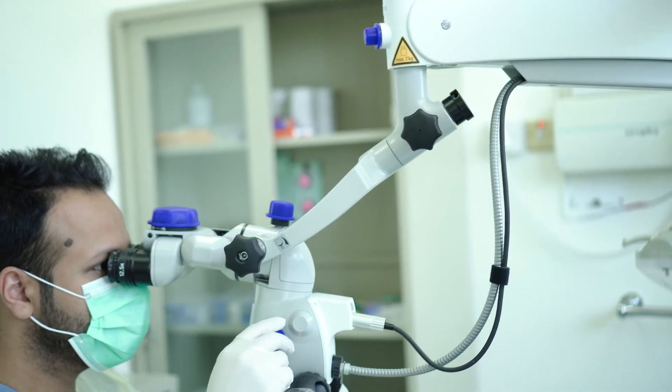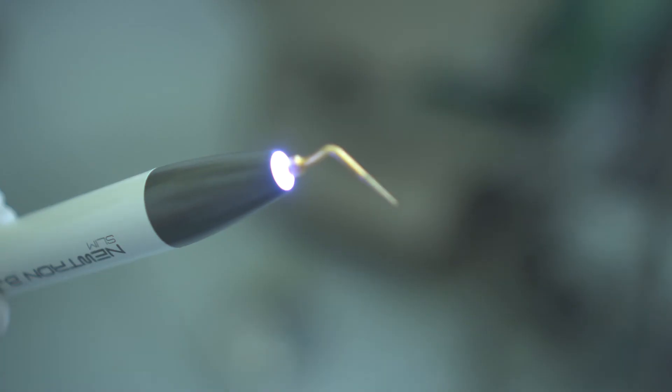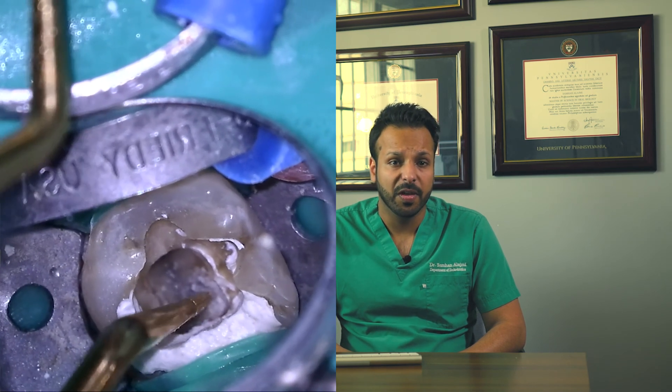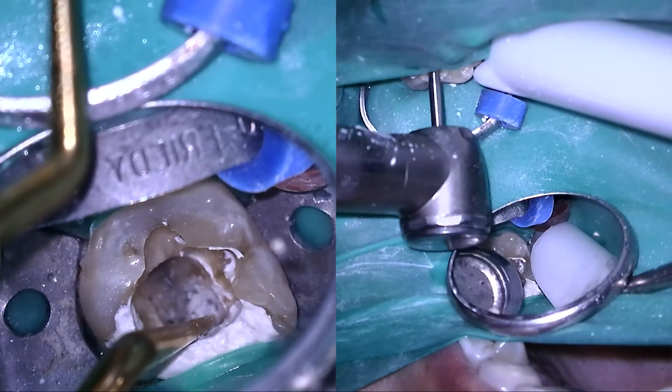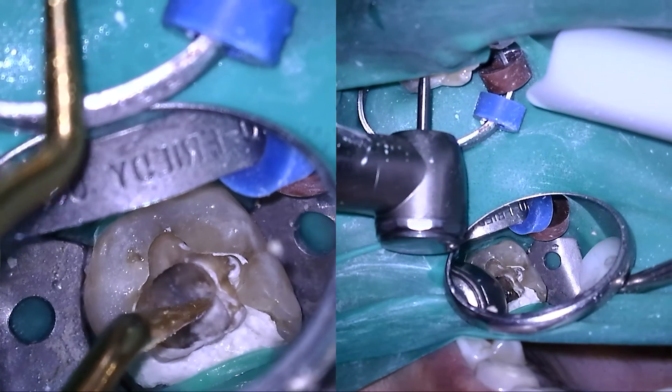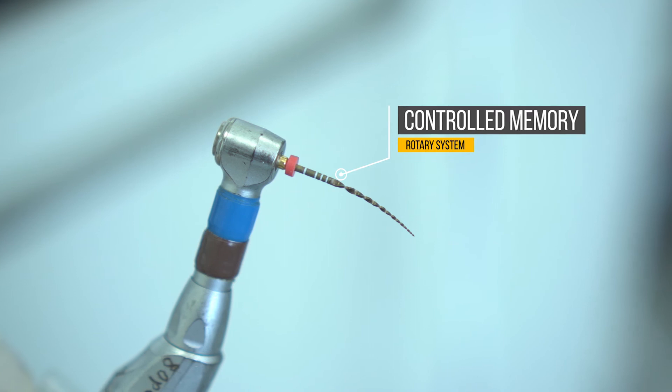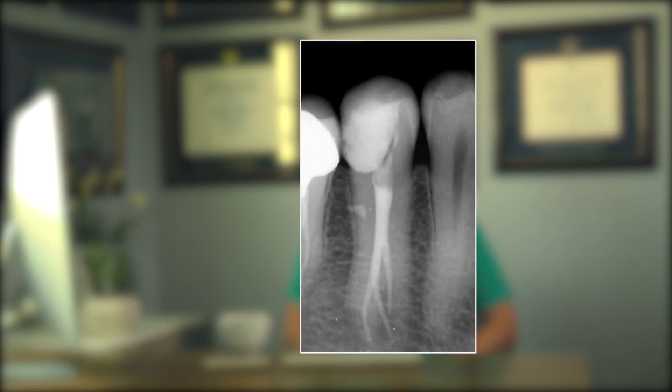In order to do that I would have to use a microscope, which is going to allow me to visualize the C-shaped canal. I would also use ultrasonic tips to give me straight access to each path that I plan to instrument - using ultrasonics is the safest way to open up canals as they are thin and you can see what you're doing, unlike handpieces which block the whole axis. And I would need a controlled memory rotary system that can be pre-curved and stay bent, so I can slide each file into the canal and instrument it precisely.